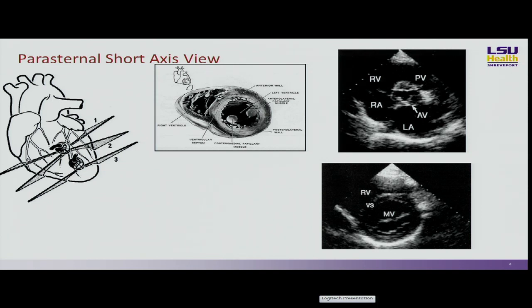Right up in the outflow tract or further beyond. You don't really see emboli very well on transthoracic, but you can pick them up if they're proximal clots. You can pick them up very easily on transesophageal because they get a much better view of the valves. So we'll use this to assess volume and contractility.